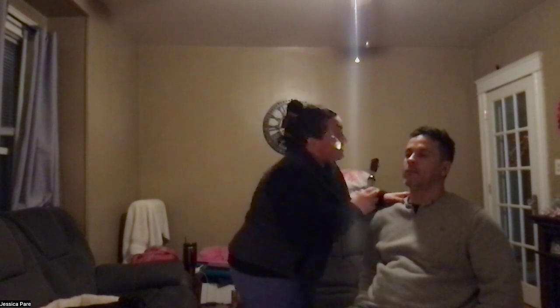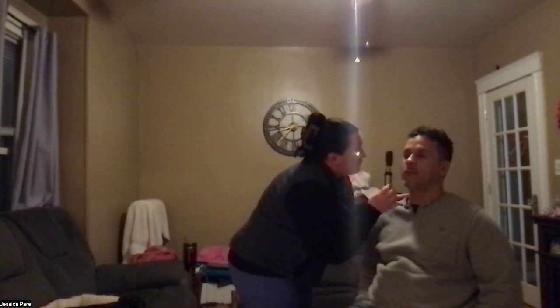We are then going to move on to the ophthalmoscope exam. I'm going to check for his red reflex and see what we can see. Ready? Oh, I see the red reflex. And I see the optic disc, the macula, the fovea, the retina. They are intact. There is no redness. There are no discolorations.